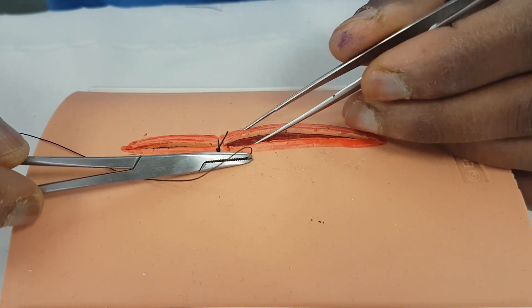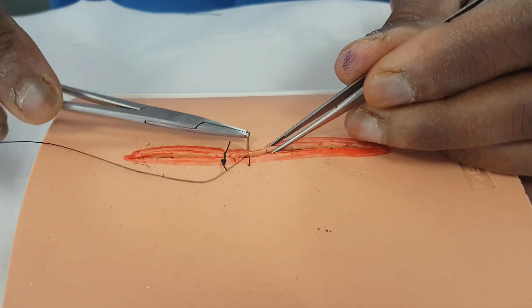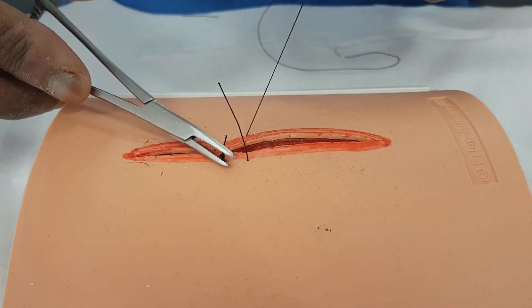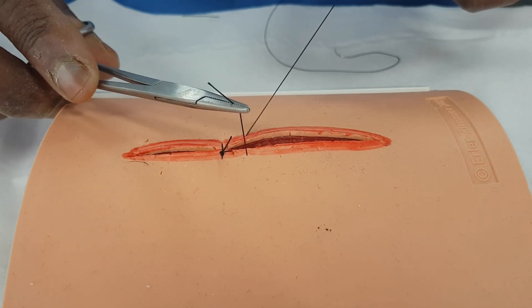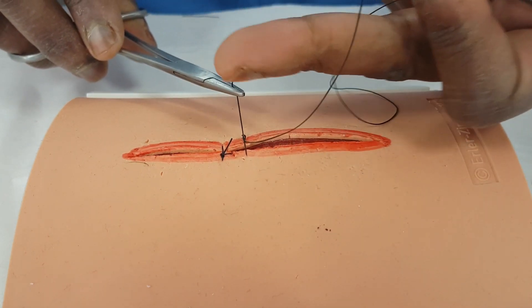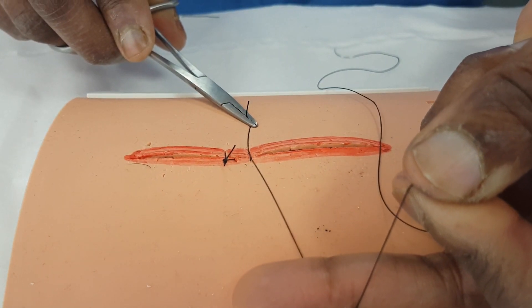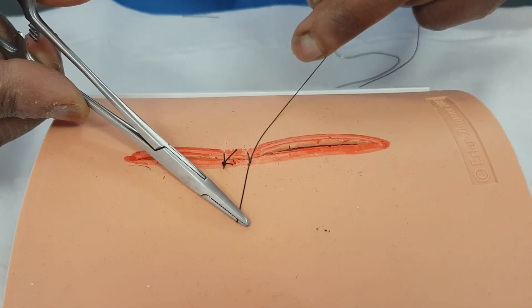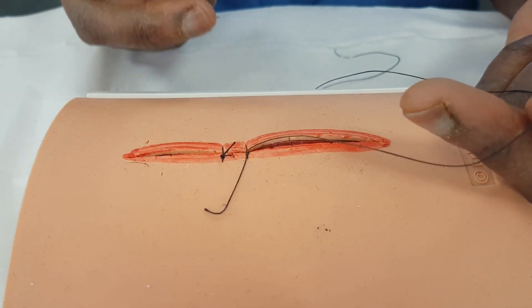That's all you've got to do. When you look at a wound, you say my next stitch is going to be such that it's square with the first one. That length of stitch isn't going to interfere with my knot — that's the magic of it, there's nothing more complicated than that. If you look at what I'm doing, I'm using my middle finger to pull that down so that the thing lies square. Put the stitch in the middle — sometimes I do one throw, sometimes two. The reason is that I'm gauging the tension required to close that wound.